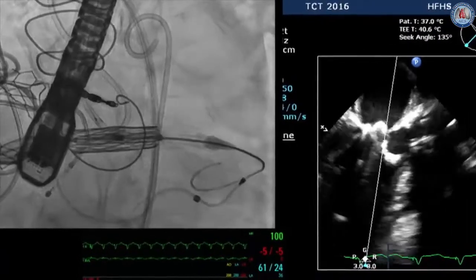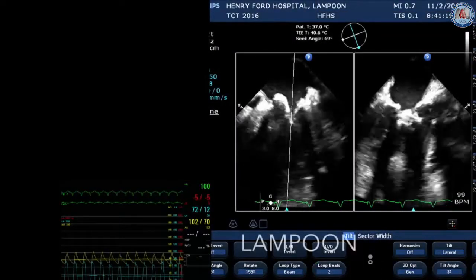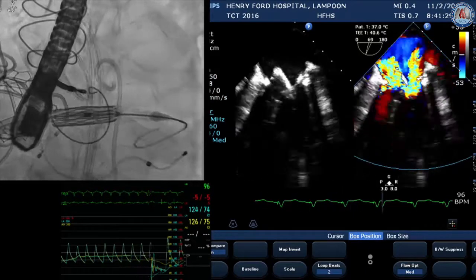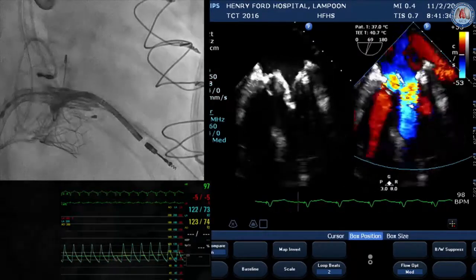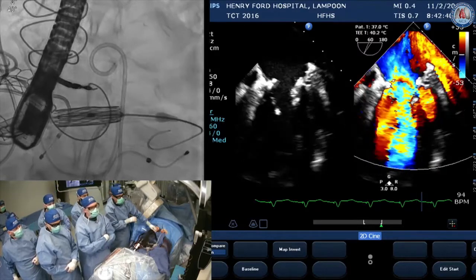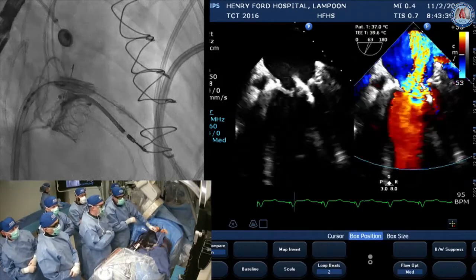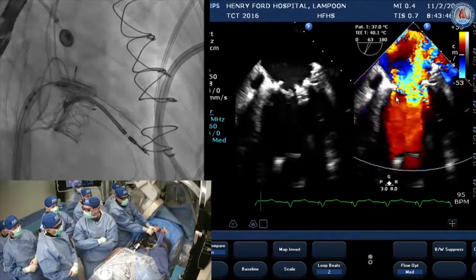Bovie on. Our blood pressure is quite good — 100 over 69. Bovie on. And now you see we've broken the leaflet. Our blood pressure is actually better. We can show on echo how much MR we have — it's a lot of MR. We've electrified the side of that wire with only two millimeters of wire exposed. On 2D TEE, the pointer is at the hole of the anterior leaflet. You can see the lopsided movement of the anterior leaflet and that hole. On color flow, you can see flow going through that leaflet at the A2 scallop. And on 3D TEE, we can visualize the laceration clearly.